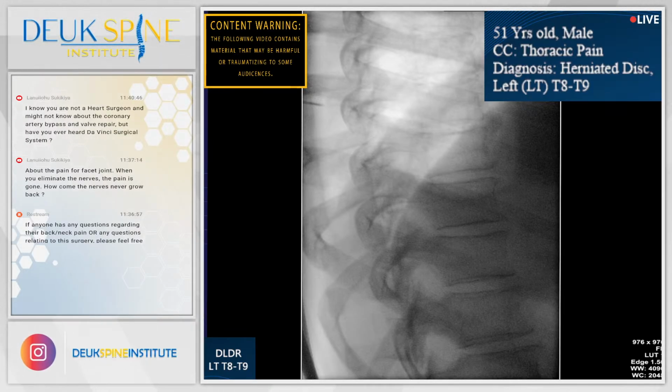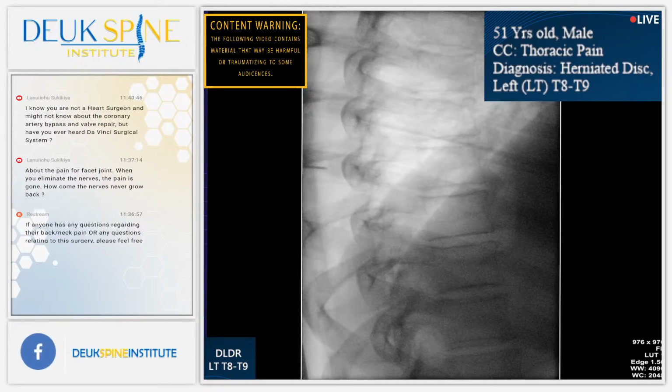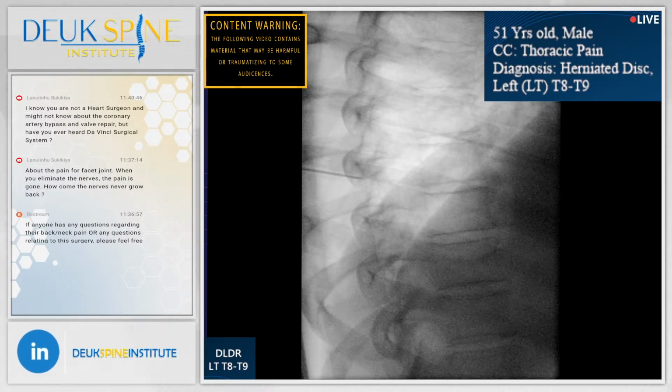Let's go back up to 8-9 so I can see it. Let's go AP.